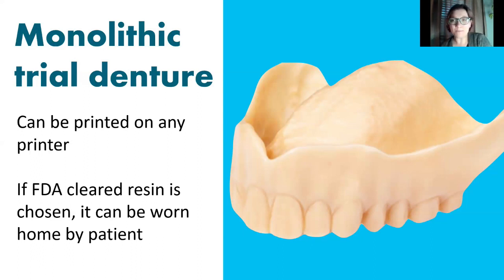There are so many benefits to letting your patient try your monolithic trial denture. So if you think about the conventional wax workflow, we have our patient try on the denture, look in a mirror for 5 or 10 minutes and say, well, do you like it? Can we process?